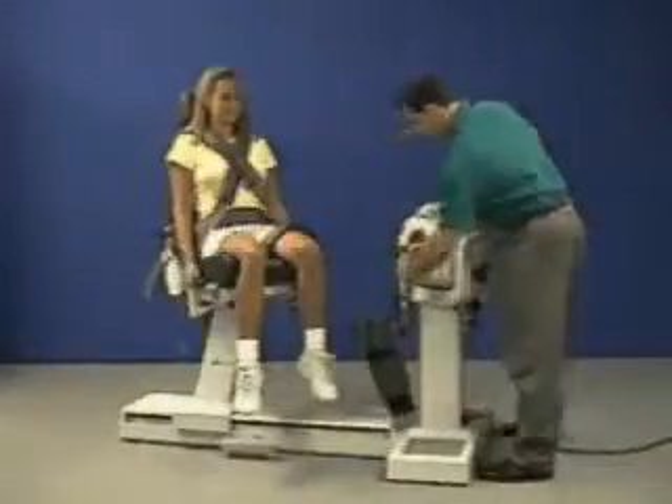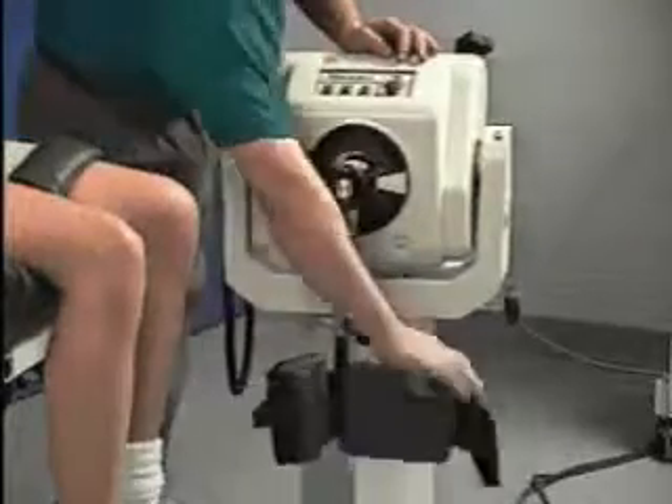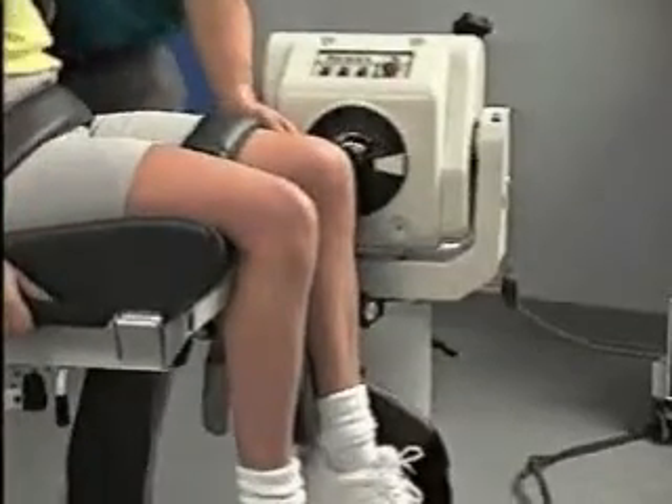Locate the attachment for knee extension flexion. Align the red dots on both the shaft and the attachment. Move the patient into position and align the dynamometer's axis of rotation with the lateral femoral condyle.